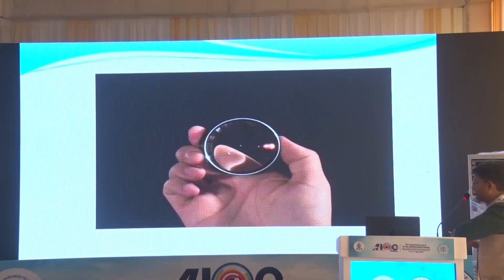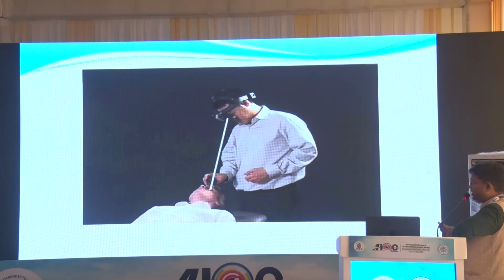Now, this is a 20 diopter lens which we commonly use in indirect ophthalmoscopy, and the painted part should be facing the patient's eye. It should be away from us. This is important. And this relates to the Gullstrand principle I was mentioning, which is applied when you focus. We'll be discussing the whole technique later. The lens should be held between your index finger and thumb, and you should move the lens with this movement only. The other three fingers are used to fix your hand over the patient's eye and to just open it. These two fingers are used for the movement of the lens.